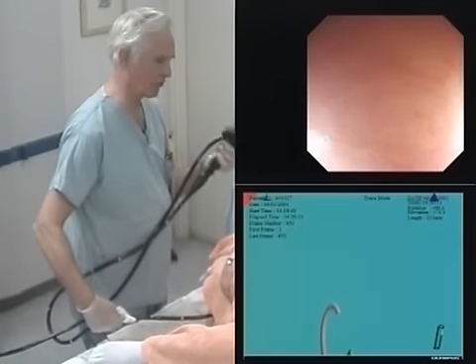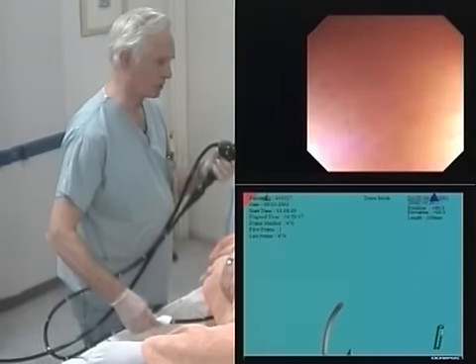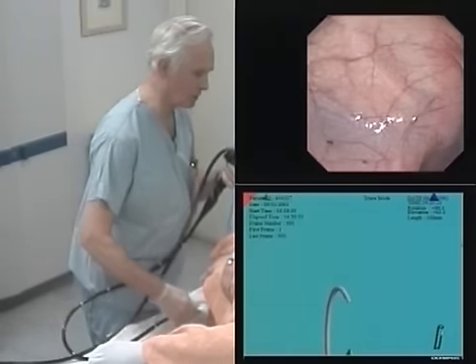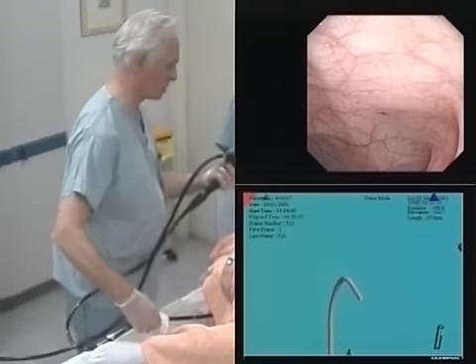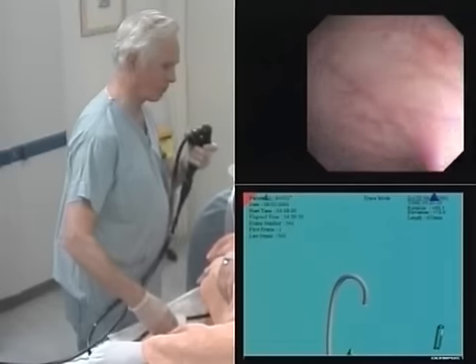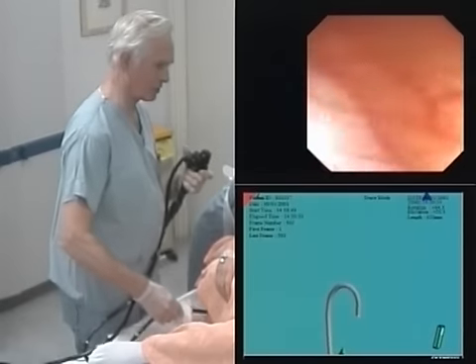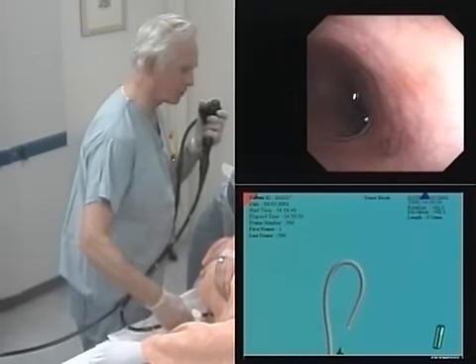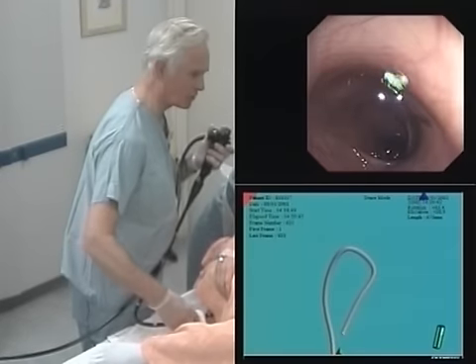So that's back out to 40. A little bit of a push. Push on the sigmoid, I think, just over the top. I'll pull back and try and keep this loop down. It's going to be a little push — stretchy, windy pressure now. A little tough for a moment. It's going very fast.